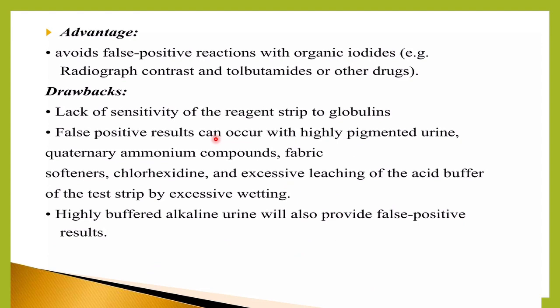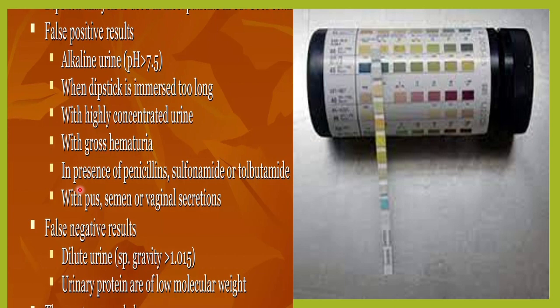Advantages include that it is very easily done and it avoids false positive reactions with radiographic contrast media, tolbutamides, and other drugs. The drawback is that it lacks sensitivity to globulins — it is more sensitive to albumins. False positive results can occur with concentrated urine, gross hematuria, pus, semen, or vaginal secretions. False negative results may occur with very high specific gravity urine, dilute urine, or low molecular weight urinary proteins.